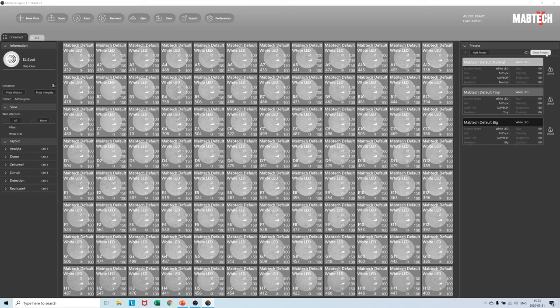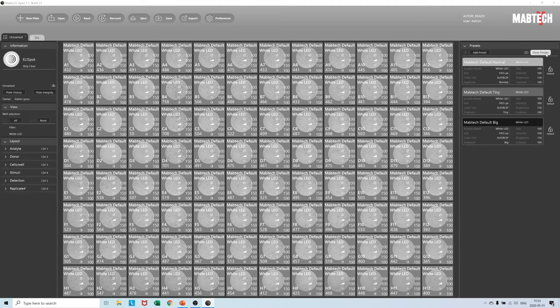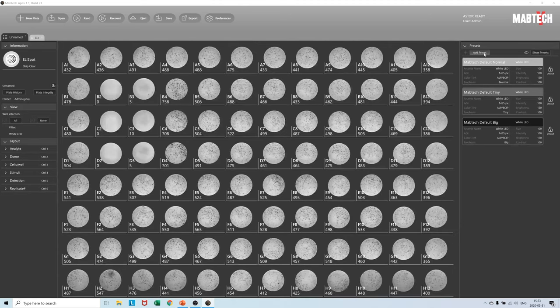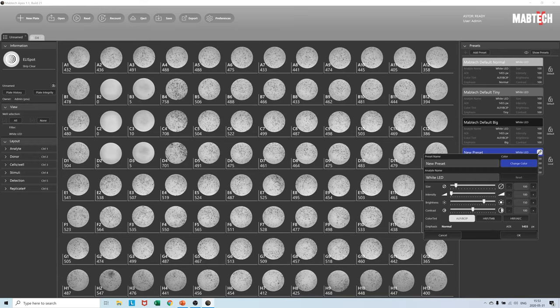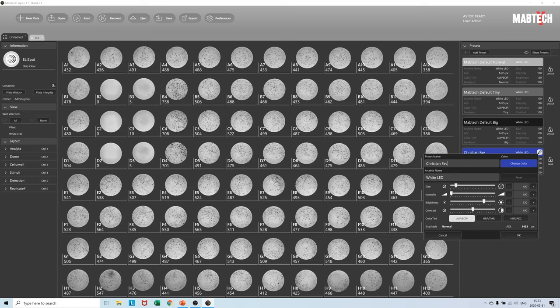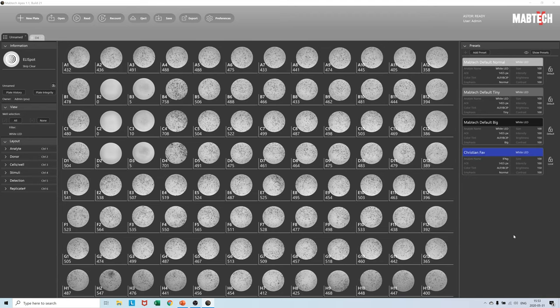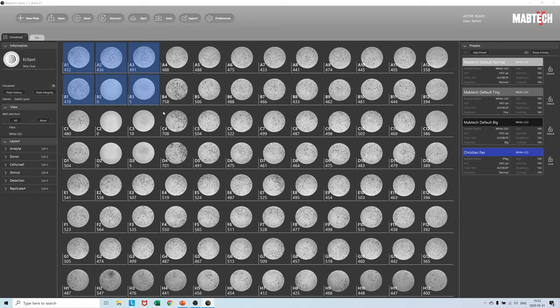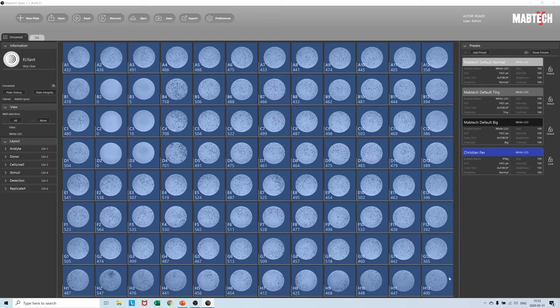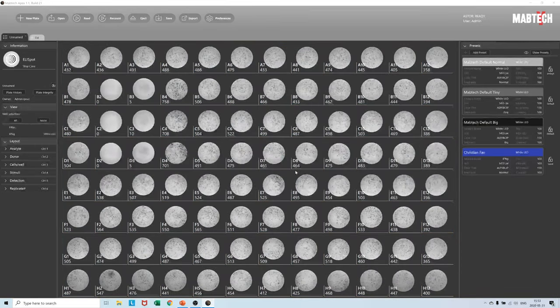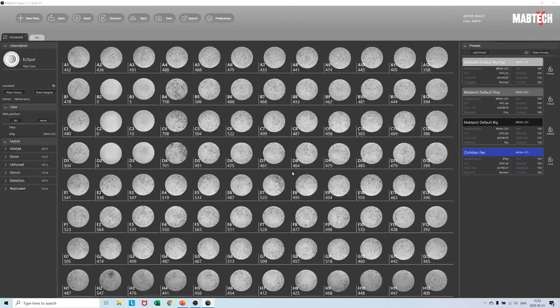We can add a preset by pressing the add preset button and configuring it according to what we want. We can name it Christian Fav, we can name it Interferon gamma for Analyte, and we can also make adjustments to brightness, contrast, size, and intensity. Once the preset has been created it can be applied to the plate view by selecting the wells you want, right clicking, and selecting the newly formed preset Christian Fav.